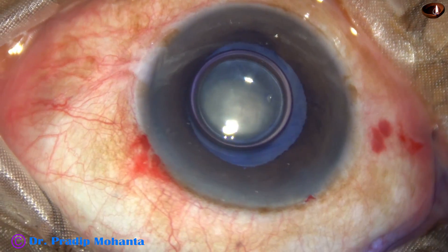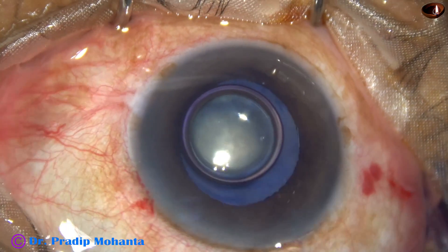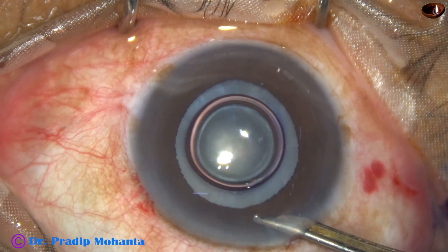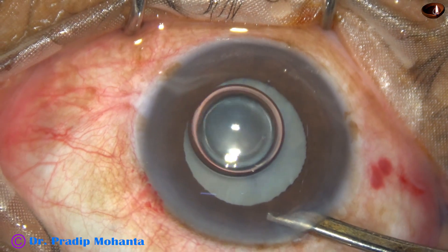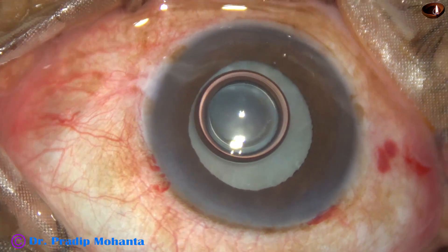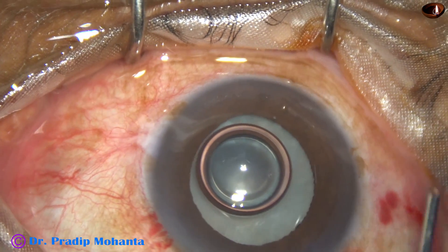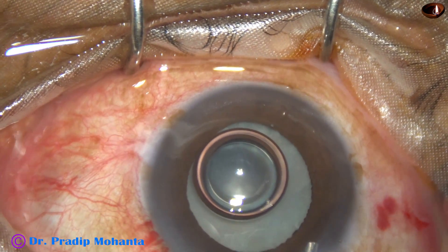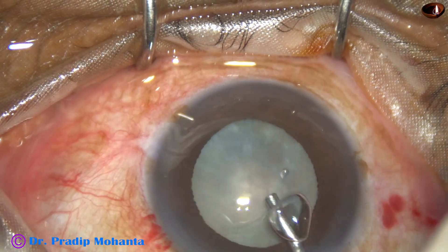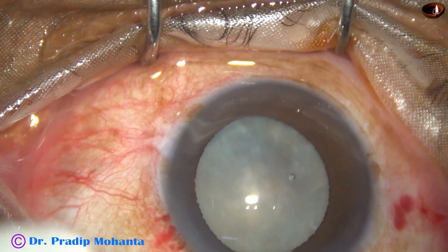The pupil is not well dilated, so a bit of adrenaline is injected. The dye is washed out. At this time the size of the pupil is adequate. As we inject visco and fill up the anterior chamber, the size of the pupil is about 6 mm.